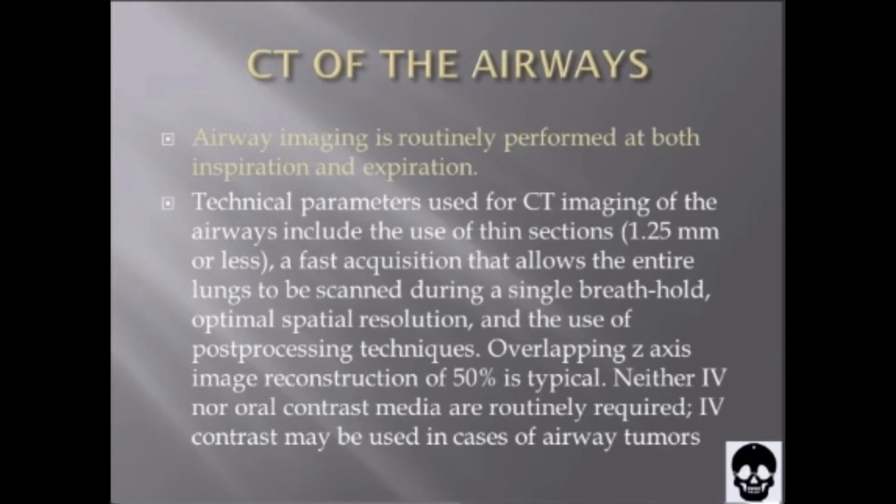Overlapping Z-axis image reconstructions of 50% are typical. Neither IV nor oral contrast media are routinely required. IV contrast may be used in cases of airway tumors. Airway imaging is routinely performed at both inspiration and expiration.